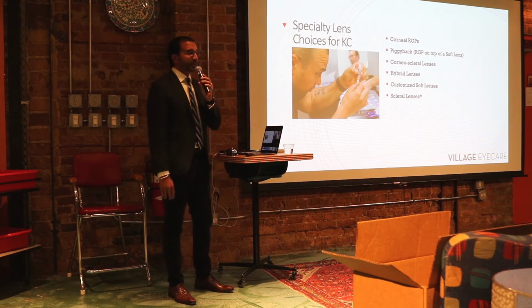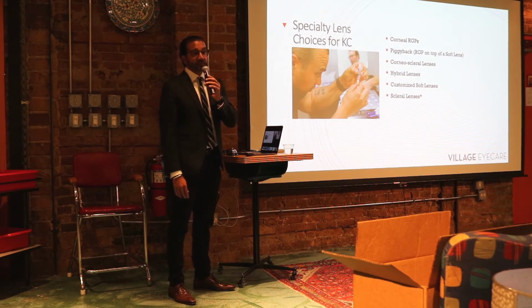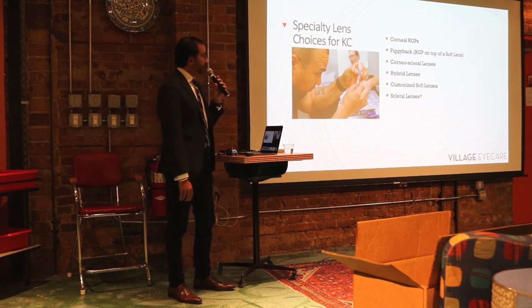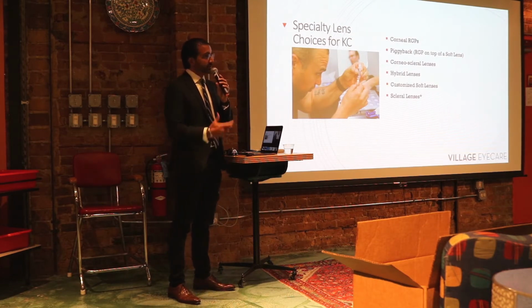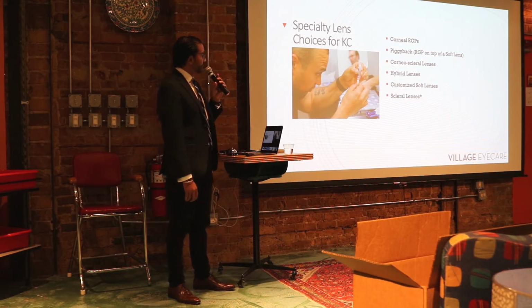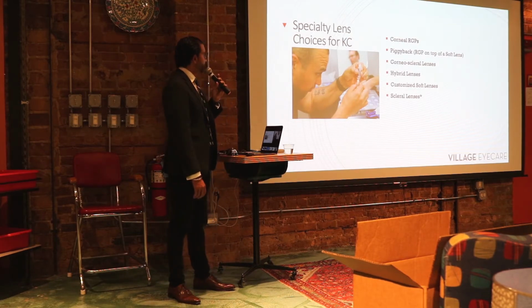Hybrid lenses are fantastic, especially for early keratoconus. You have a mild cone, and the lens is effectively an RGP lens in the center, bonded to a soft skirt periphery, so you get the vision correction benefits of that RGP material and the comfort more like a soft. Hybrids, though, also have some limitations, including not being as good with vision correction for more advanced cones. Also becoming very tight towards the end of the day on a more moderately curved cornea. Removal also can be difficult for some patients as well.